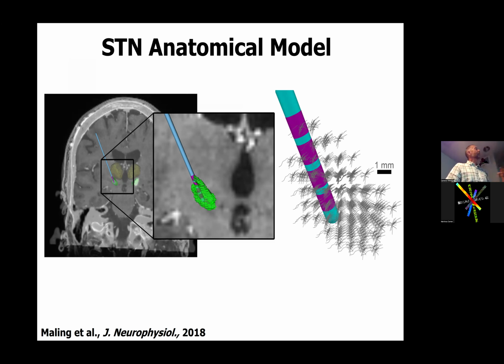And then you could think about, well, each little voxel, if you will, of that subthalamic nucleus, I could put a little STN neuron model there. And then I could have ideas of the currents that are being generated by each one of those little neurons, and then start to back calculate what would be the local field potential recording I might expect to get at these different electrode contacts, right? So an old school clinical deep brain stimulation electrode would have 4 contacts on it. Nowadays, the modern electrodes have 8 contacts. And in fact, later this year, we'll have 16 contact DBS electrodes.